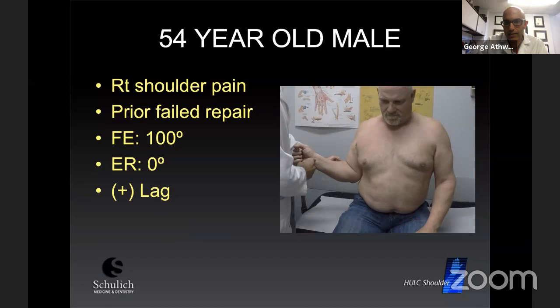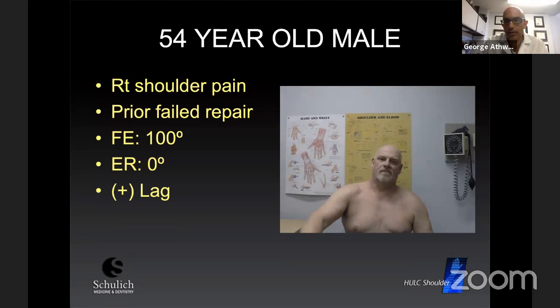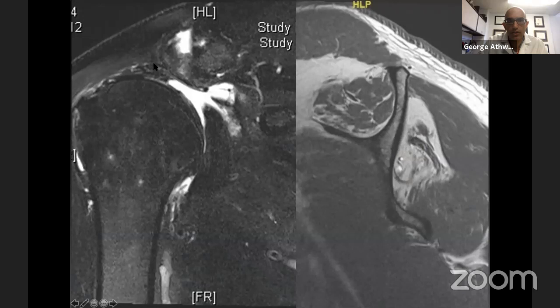Because he had failed a prior rotator cuff repair and has a massive supra- and infraspinatus tear with an external rotation lag sign, I indicated him for a revision repair and a lower trapezius tendon transfer. Here's his MRI. You can see on the left, a massive cuff tear. On the sagittal images, grade 4 fat infiltration within the infraspinatus, some atrophy, and maybe grade 2 or 3 supraspinatus fat infiltration.